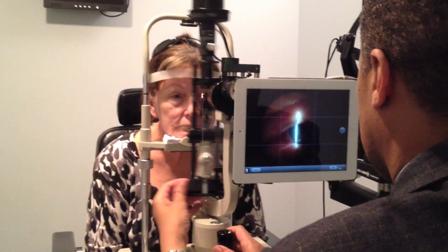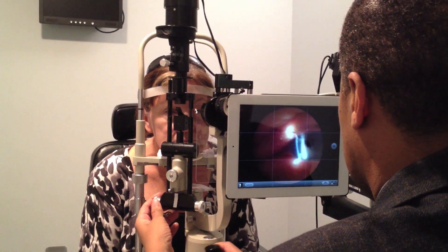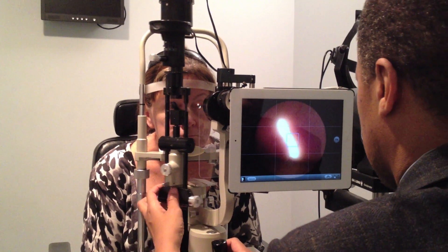Steve is at the slit lamp taking a picture of a patient who had a cataract three days ago, and he's focusing in the eye. Notice that the exposure values are not ideal — the brightness of the slit lamp is too bright, and so he has a choice.